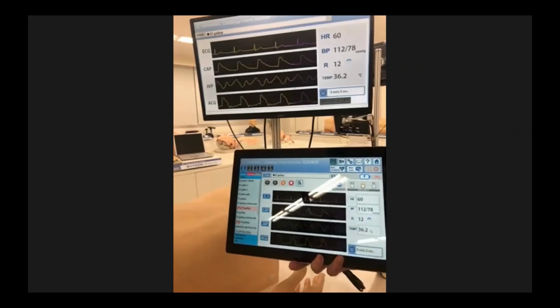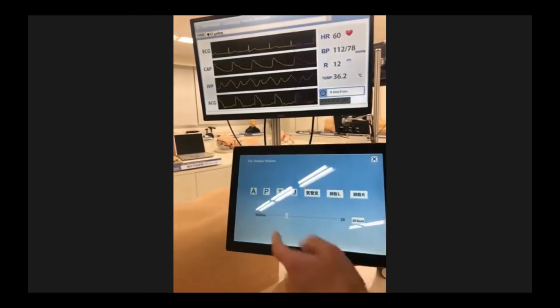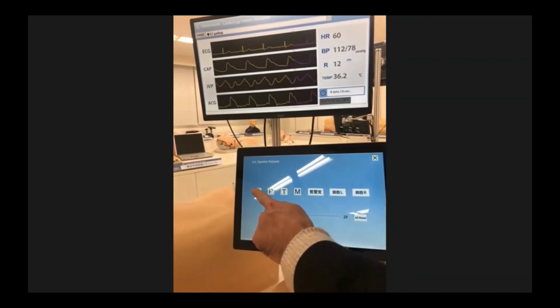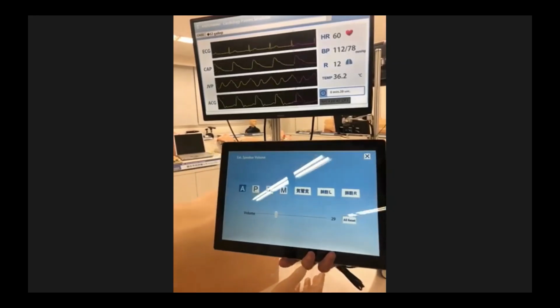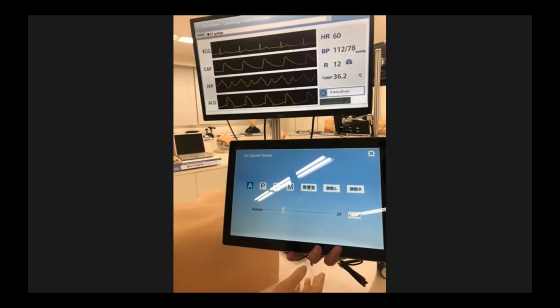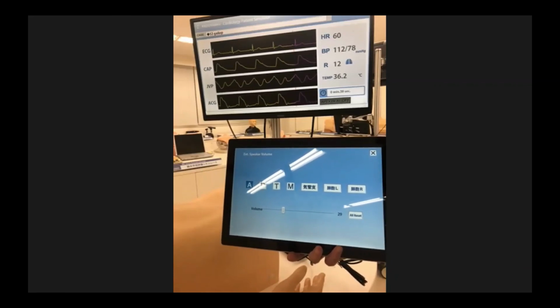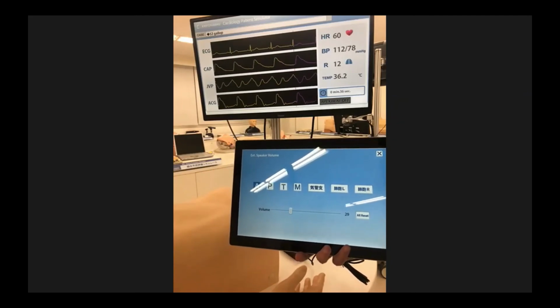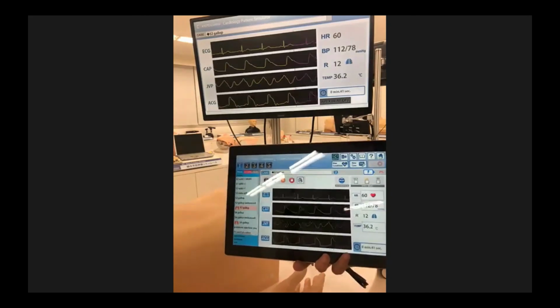And also, the teachers can, as we mentioned, play these sounds through the external speaker, just like one touch like this. So this is the sound that is going on inside the thorax and what the students can hear with their stethoscope. And this way, the teacher shows everybody how the sound is, and then they start auscultating with their stethoscope.